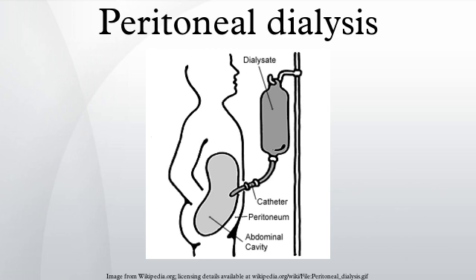Also monitored is the color of the fluid removed. Normally it is pink-tinged for the initial 4 cycles and clear or pale yellow afterwards. The presence of pink or bloody effluent suggests bleeding inside the abdomen, while feces indicates a perforated bowel and cloudy fluid suggests infection. The patient may also experience pain or discomfort if the dialysate is too acidic, too cold, or introduced too quickly, while diffuse pain with cloudy discharge may indicate an infection.